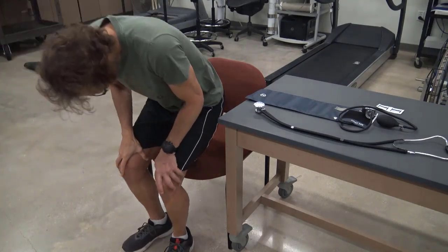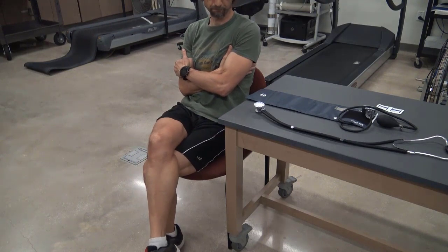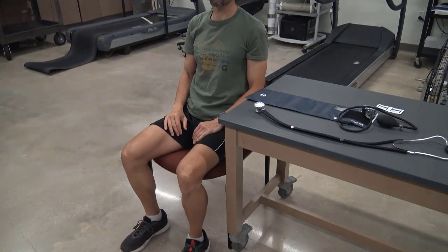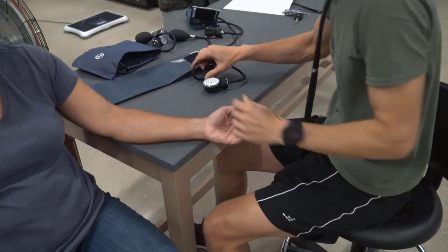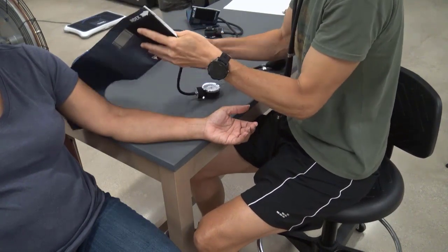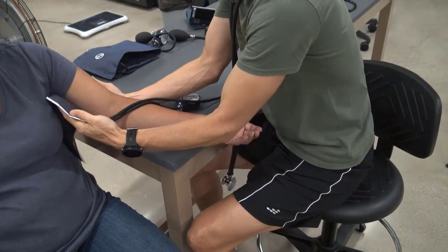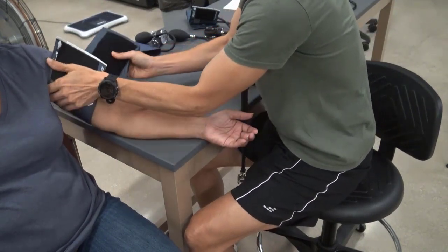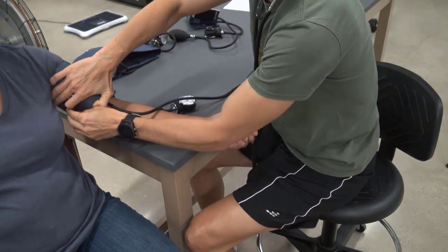Before taking blood pressures, be sure your patient sits comfortably for at least 5 minutes. The arms should not be crossed, the feet should be flat on the floor, and the legs should be uncrossed as well. Position yourself to the left of the patient and in front of them — it's best to be near the corner of the table. Be sure the upper arm is at the level of the heart. Always fit the cuff on the left side and as far up on the arm to keep the distal portion exposed, which is about 3 centimeters or an inch above the elbow.